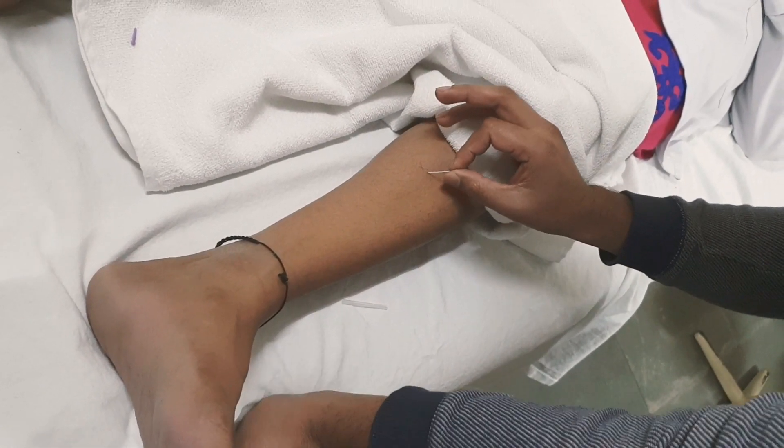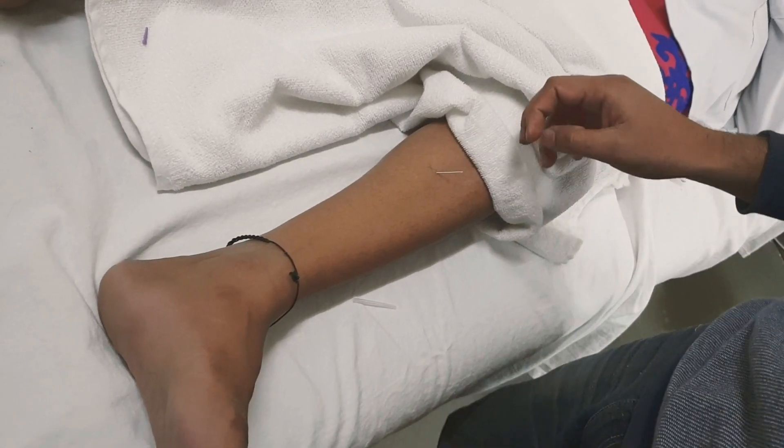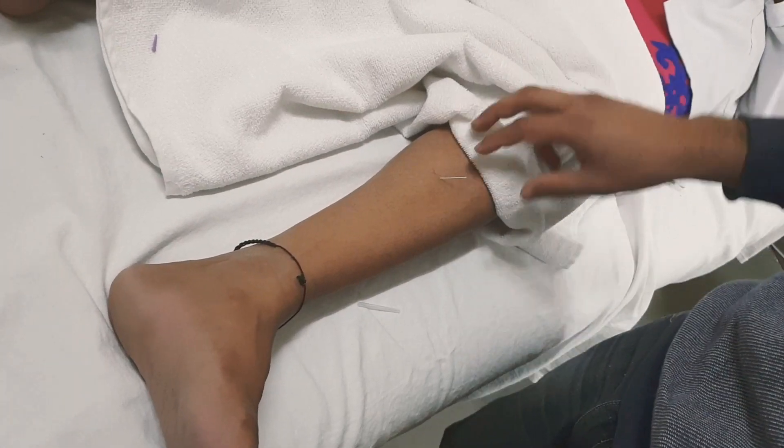You can roll it to unfold or leave it here for a few seconds. This is all about the dry needling for tibialis posterior.